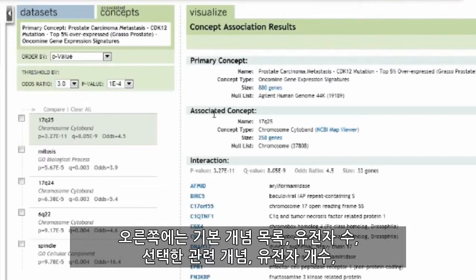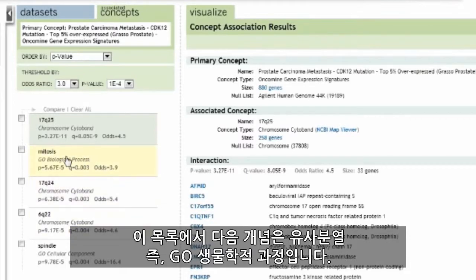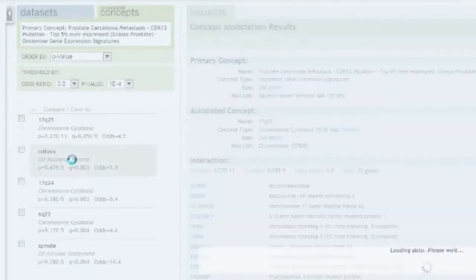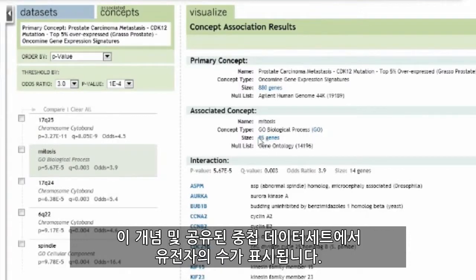To the right, we see our primary concept listed, the number of genes, the associated concepts selected, the number of genes, and the interaction or overlapping gene set shared between the two concepts. The next concept in our list is mitosis, a GO biological process. By highlighting mitosis, we see the number of genes in that concept and the shared overlapping gene set.